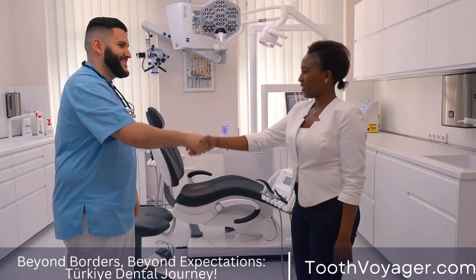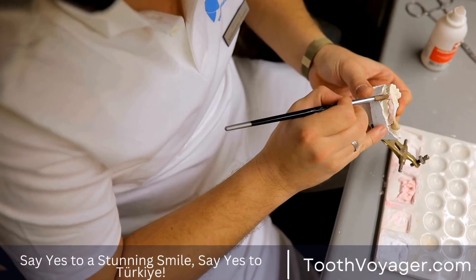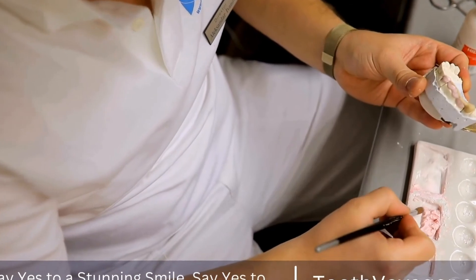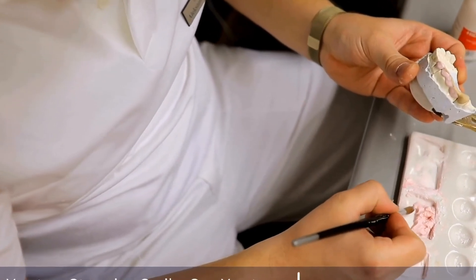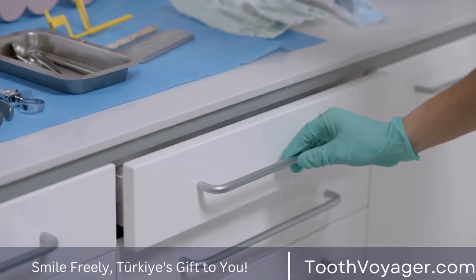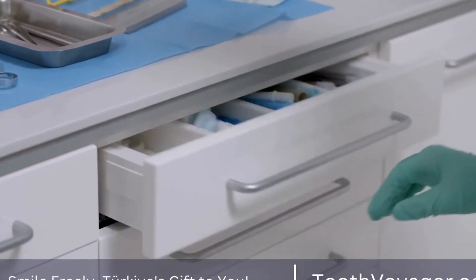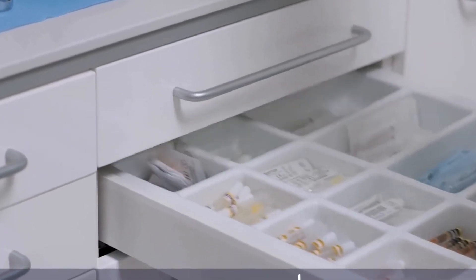Zygomatic dental implants are a specialized type of implant used when there is insufficient bone in the upper jaw to support traditional implants. These implants are longer and anchor into the zygomatic bone, or cheekbone, instead of the maxillary bone, providing a stable foundation for the restoration.